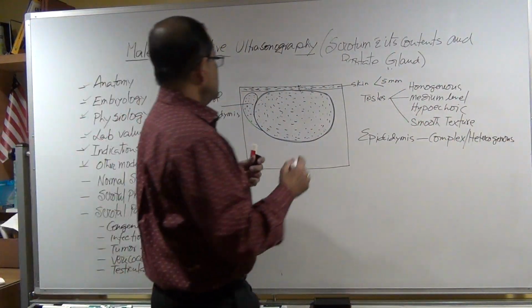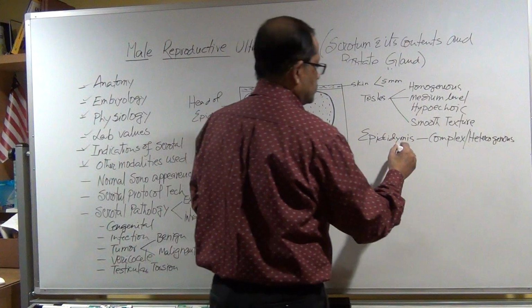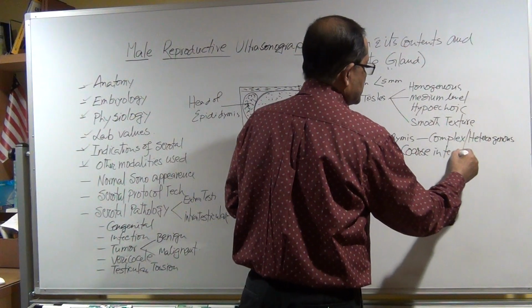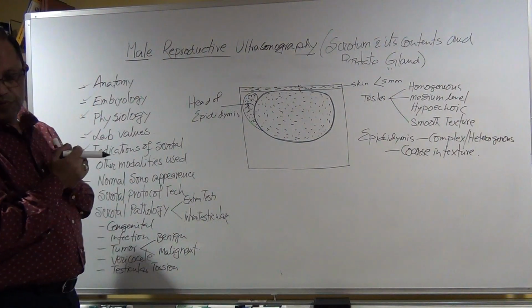It's coarse in texture. Coarse in texture. Epididymis.